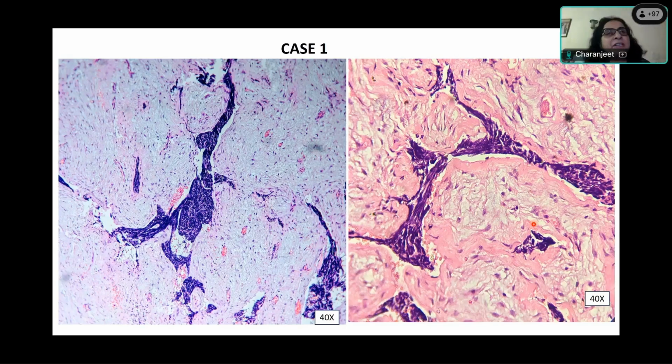So in a desmoplastic small round blue cell tumor, what is the very, very characteristic morphology that you see? Ma'am, abundant stroma showing this desmoplastic reaction. Desmoplastic reaction surrounding the blue cell nests. Yes. So the two characteristic features are you have blue cell nests, and surrounding the blue cell nests, you have abundant desmoplastic stroma. Okay, Dr. Protest, what is the third differential that you would think of? Just on morphology, what would you think of?